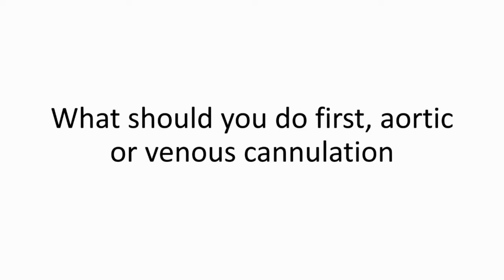The answer is heparin. We must give heparin before putting a patient on bypass. The reason we must give heparin is because when we drain the blood from the patient into the machine, remember that machine is full of prosthetic material. You've got a heat exchanger, you've got a filter, all these things. And so if you drain that blood without giving heparin, it's going to clot. And then you're going to return a bunch of clotted blood back to the patient and they'll just stroke off and die. So that's why you have to give heparin.